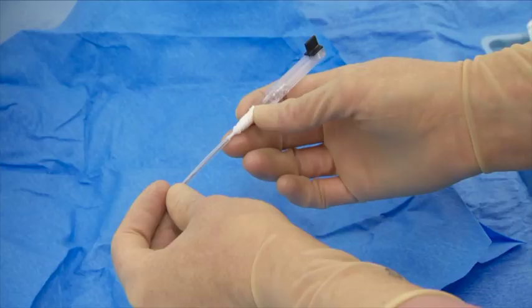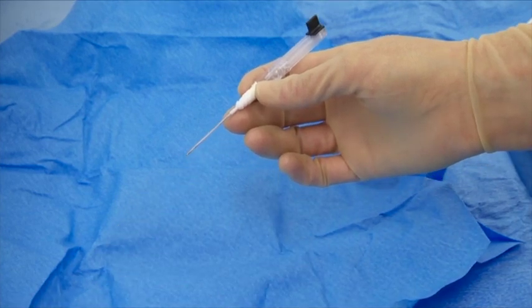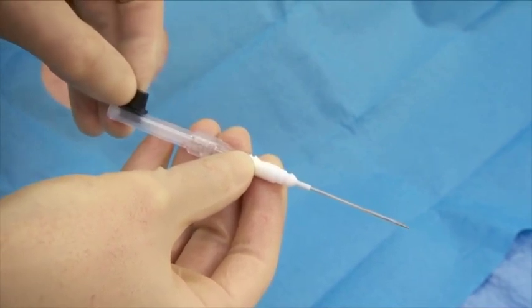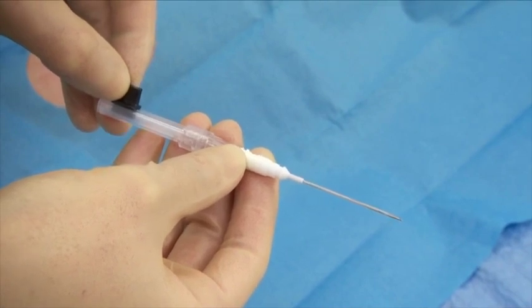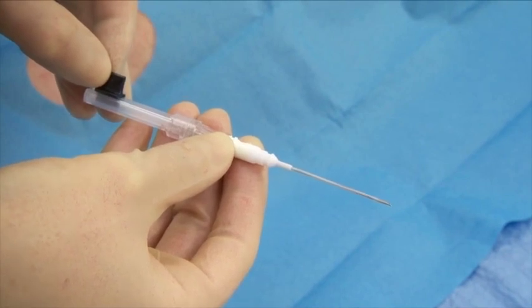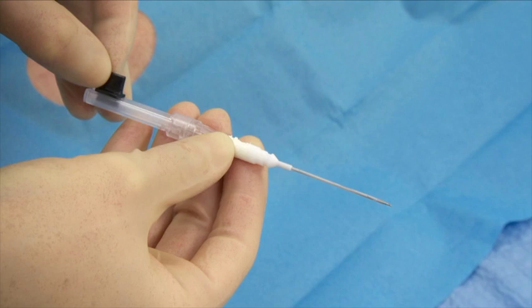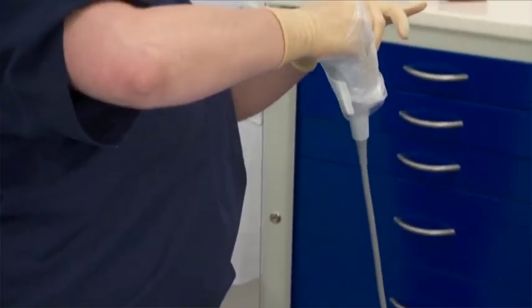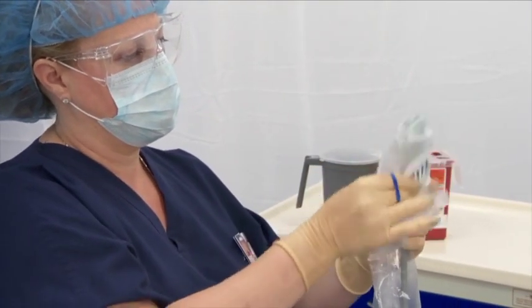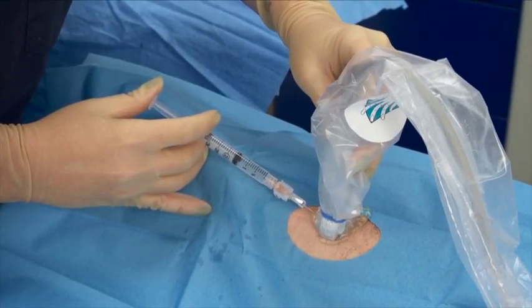Now we will review the catheter prior to insertion. Remove the protective shield from the placement device. Be sure to test the advancement and retraction of the spring wire guide through the needle using the spring wire guide handle to ensure proper function. Prior to insertion, the spring wire guide handle must be returned to the original position before insertion or blood flashback may be inhibited. Next, don a sterile probe cover using sterile technique. Once covered, the probe needs to be maintained on a sterile field.